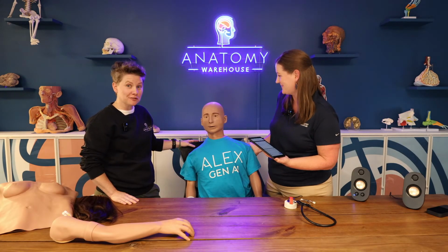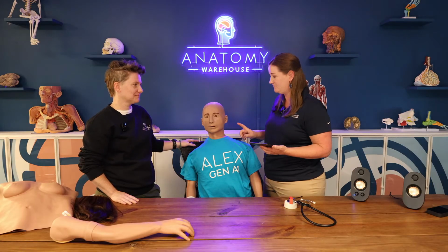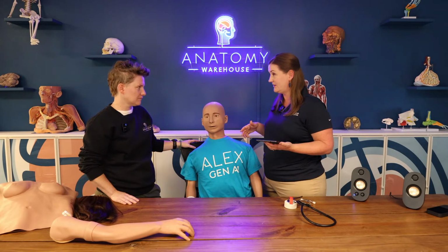That sounds critical. Yeah, he keeps buzzing me. So things like that are one of the things that make it a little bit interesting to work with a Wi-Fi and online mannequin.